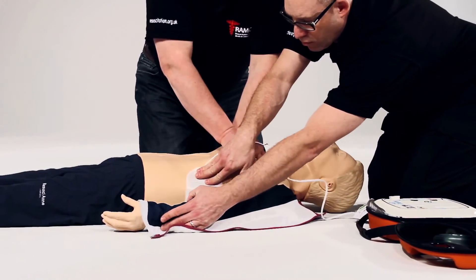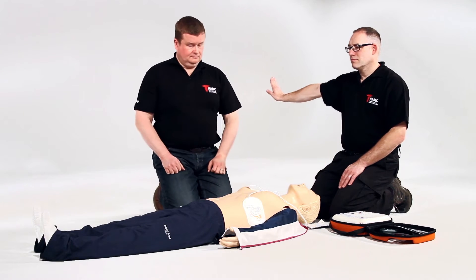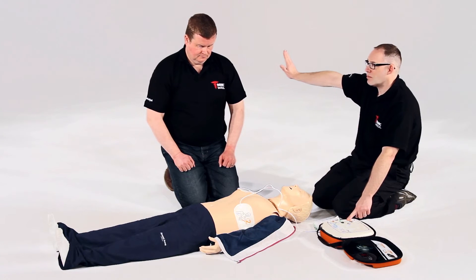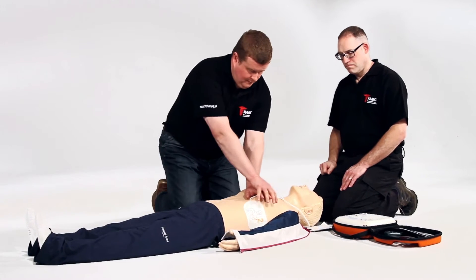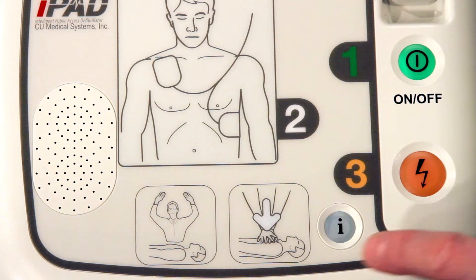Do not touch the patient. Analyzing heart rhythm — stand clear. Shock advised. Stand clear. Press the flashing orange button now. Deliver shock now. Stand clear. Shock delivered. Carry on. Begin CPR now. Press the flashing blue I button for CPR voice prompt.